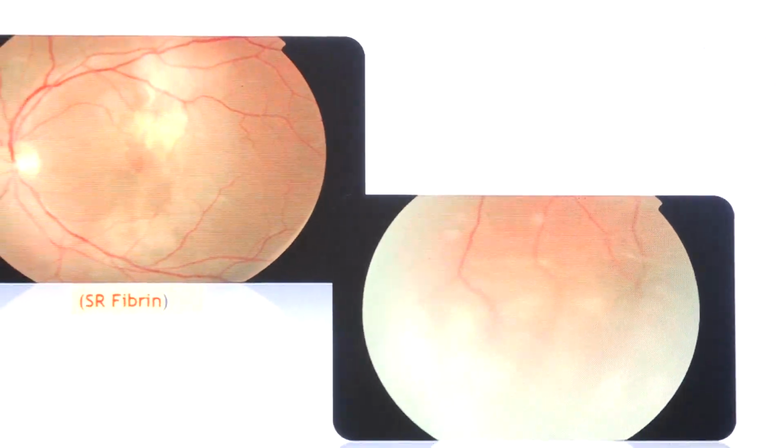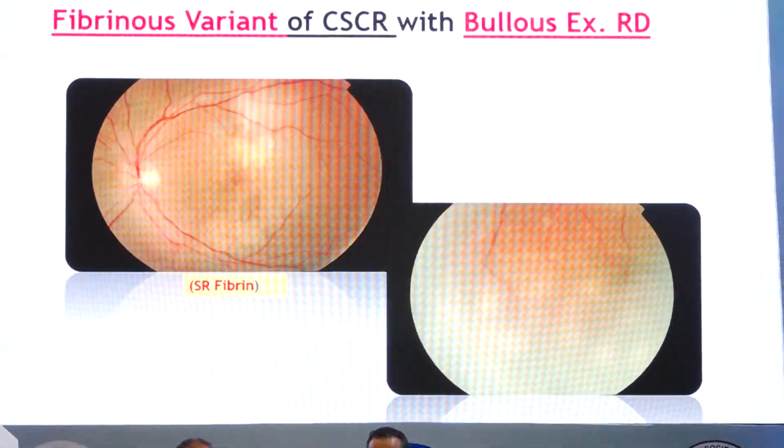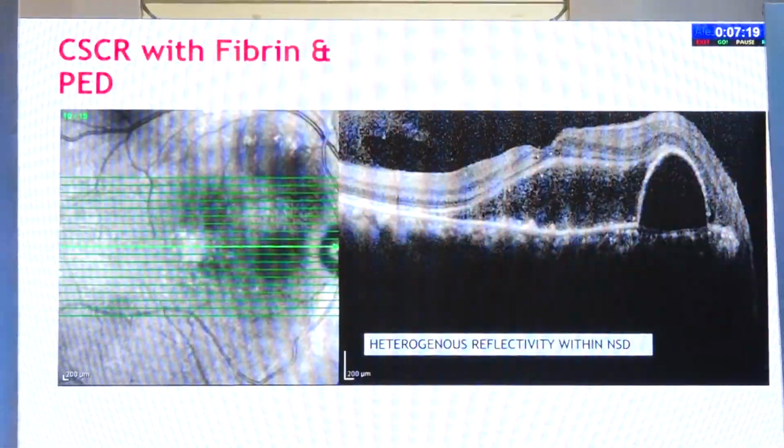As we know, the swept-source OCT in an acute CSC shows the serous macular detachment overlying a thick choroid with dilated outer choroidal veins, and we see variants with fibrinous exudation as well as exudative retinal detachment as more complicated types of central serous chorioretinopathy.